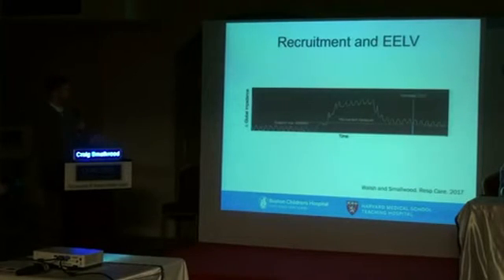So here's a time base. We looked at a few snapshots and looked at the actual image. You don't necessarily have to look at the image. You can look at the relative changes in global impedance as you increase PEEP or make recruitment maneuvers as a function of end expiratory lung volume. End expiratory lung volume, we don't necessarily call FRC, but that's really a surrogate. That's what we use that nomenclature to denote.